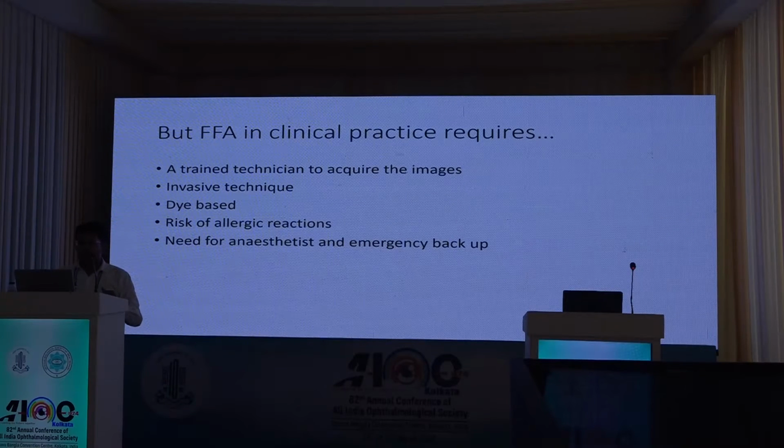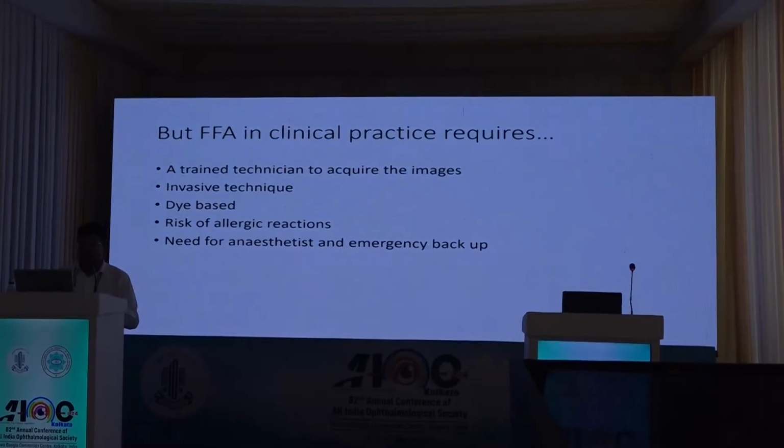But to run a fluorescein angiography in clinical practice, especially with general ophthalmologists and medical retina specialists, what you require is a trained technician to acquire those images. It's an invasive technique which is dye-based, and it has a high risk of allergic reactions, and therefore you end up having an anesthetist or an emergency backup which is required in these cases.